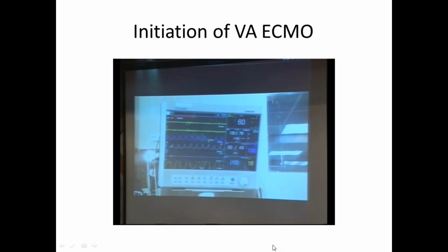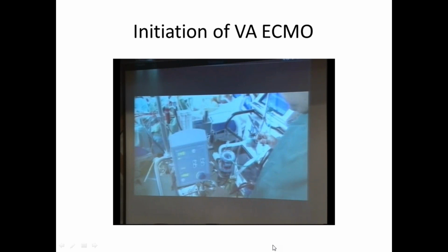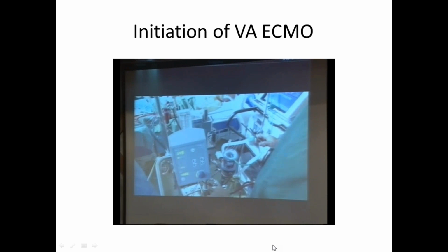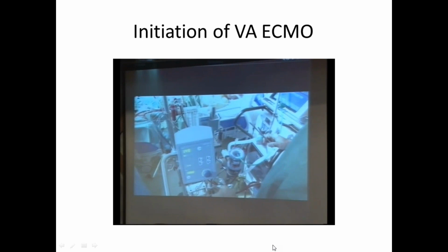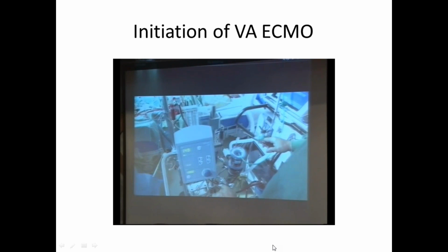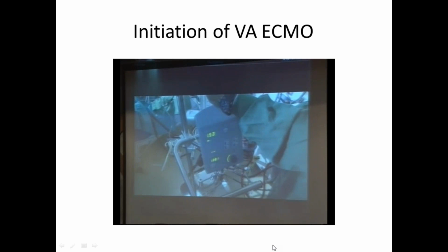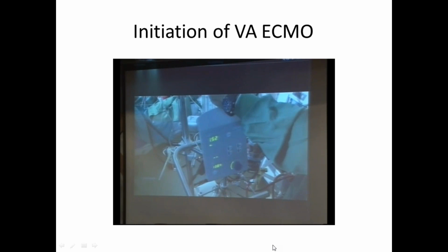Post-pump the pressure is going to be very high, so we cannot connect. It has to be connected pre-pump only. But usually we don't prefer to connect anything to the circuit and give anything to the circuit, unless it's a dire emergency. Otherwise, no. There is infection as well as some chance of air going inside, and so that is the problem.